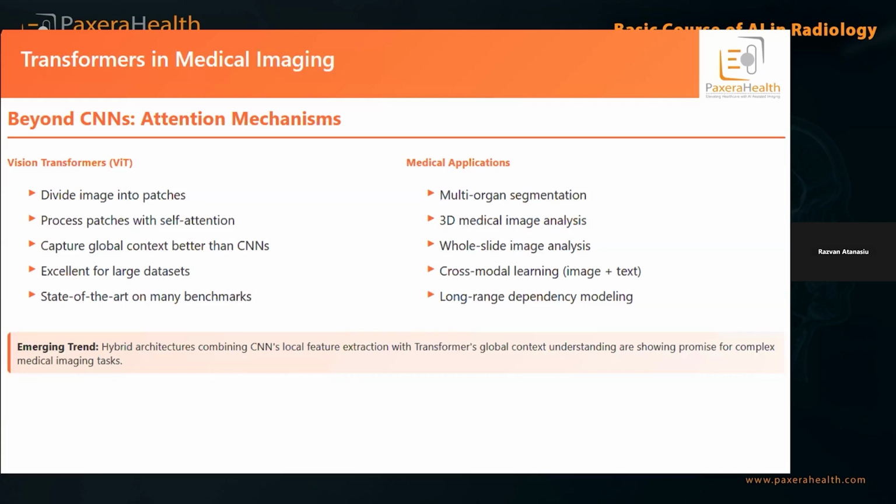So here's another example, and Dr. Halabi also alluded to it. You can go from a vision transformer to text, right? Because that's the multimodal thing. And many of you have experienced this: here's a description of a video or an image, and the image gets generated, or the other way around, where you have the image and you say, okay, describe what you're seeing. Well, from a medical perspective, you could even generate a report from a medical image.